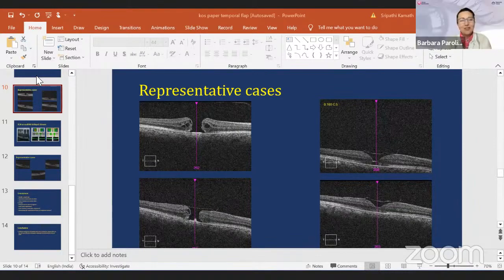Yeah, I totally agree. It's like retinal detachment. If you look at your surgery, all your patients, the worst are always retinal detachment and macular hole. You never know what happens the day after, almost. I agree with Barbara and Dr. Elreis. I think the important thing is whatever you do, whether you do a temporal flap, a multi-layer flap, or you just do a regular inverted flap, don't stuff it inside. Otherwise, all of them seem to work. Depending on what's more convenient for you and what works best for you, you just choose the technique.